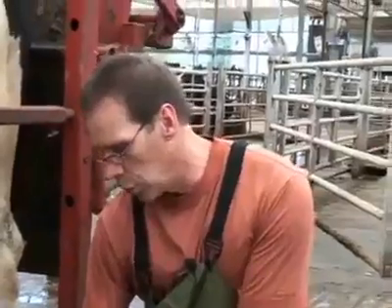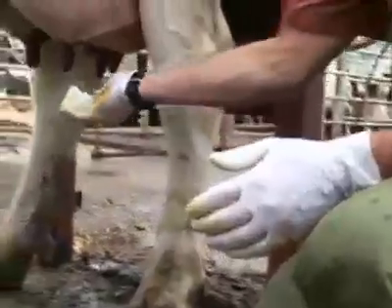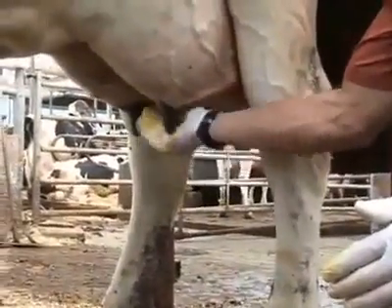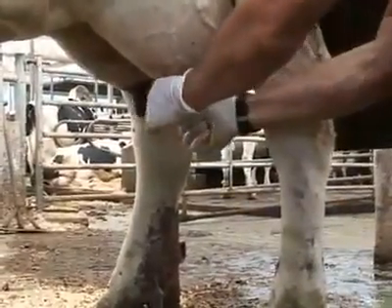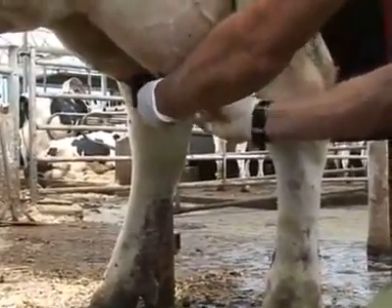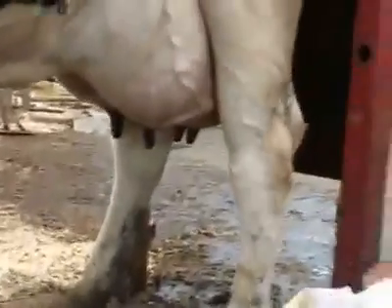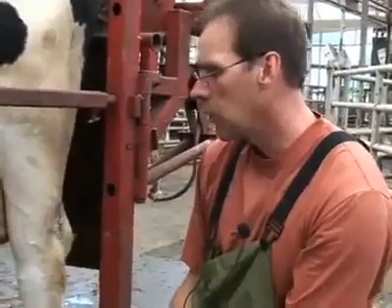That's how long it takes for iodine to kill any surface contaminants that we do not want to end up in our sample vial. After 30 or 40 seconds, we will clean away all of the iodine by using alcohol wipes. Again, we'll take all of the iodine off of the cow's teat, aggressively cleaning the entire teat surface, and then very much paying attention by turning the swab over to the clean side, cleaning the very tip of the teat aggressively.